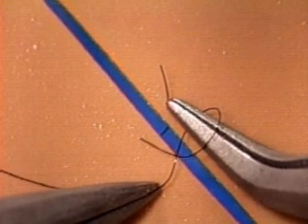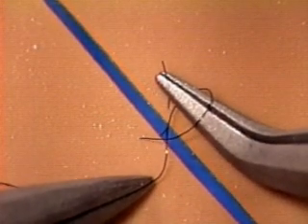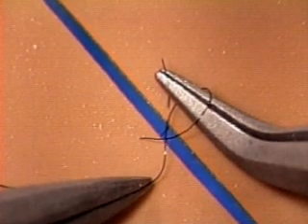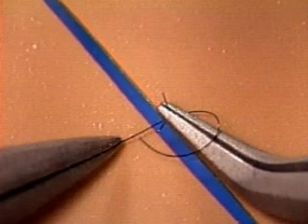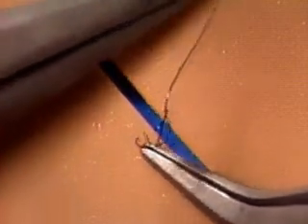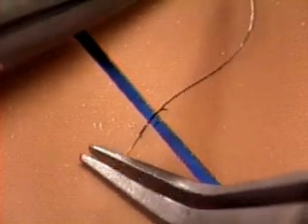As for Act 3, I've told you about that already. Provided the tip of your forceps is pointing in the right direction, there's nothing to it. Just pick up the thread and move straight on to Act 4, pulling the short end through the loop. Pull the short end across the wound in one direction and pull the loop length across it in the other direction, and your half knot is complete.